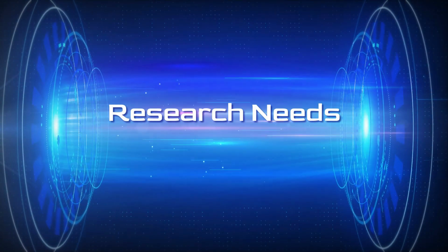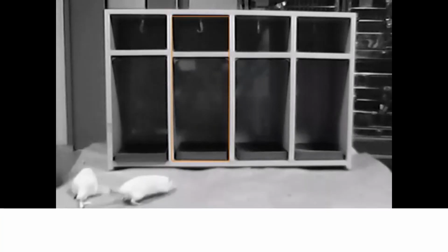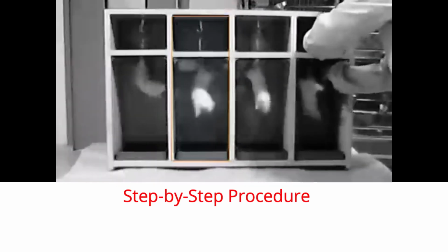In this video, we will see the tail suspension test. What is the procedure and how can we do it? You can see it in the video. I have started the video, and in it we will first see the steps of the procedure.